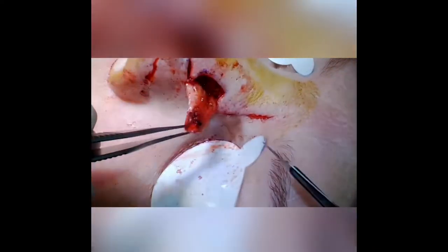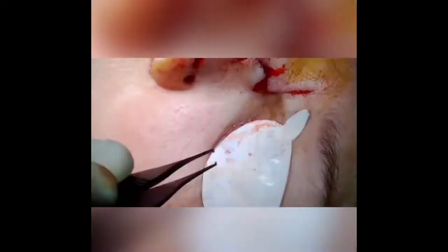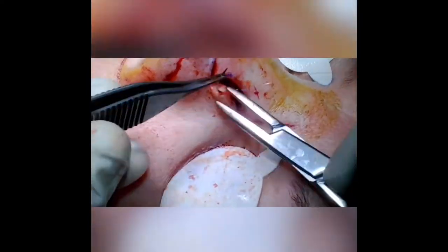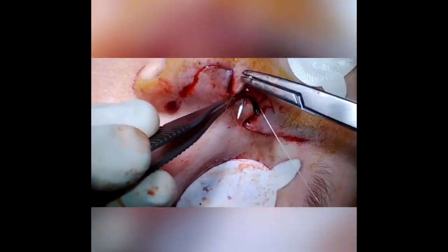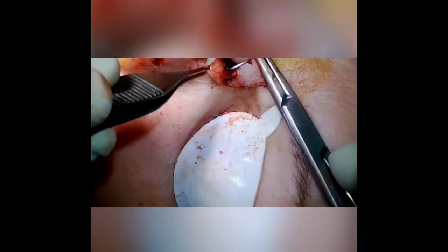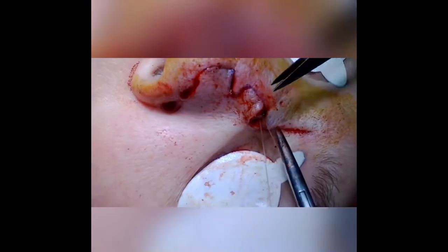Once I've finished insetting the first lobe, I'll trim the excess of the second lobe. I try to make the second lobe with right angles rather than rounded edges. This leads to less trap-dooring and helps irregularize the scar. The second lobe always ends up being more of a rectangular shape rather than a rounded shape like the first lobe.